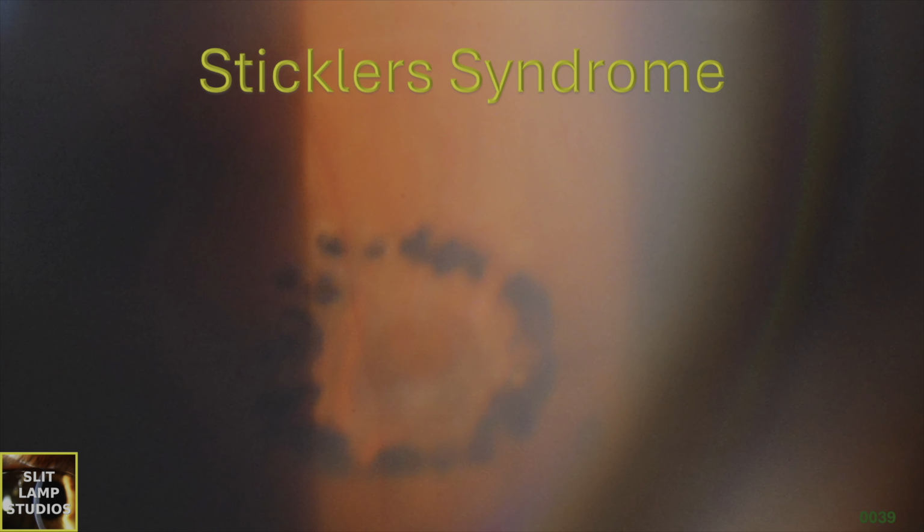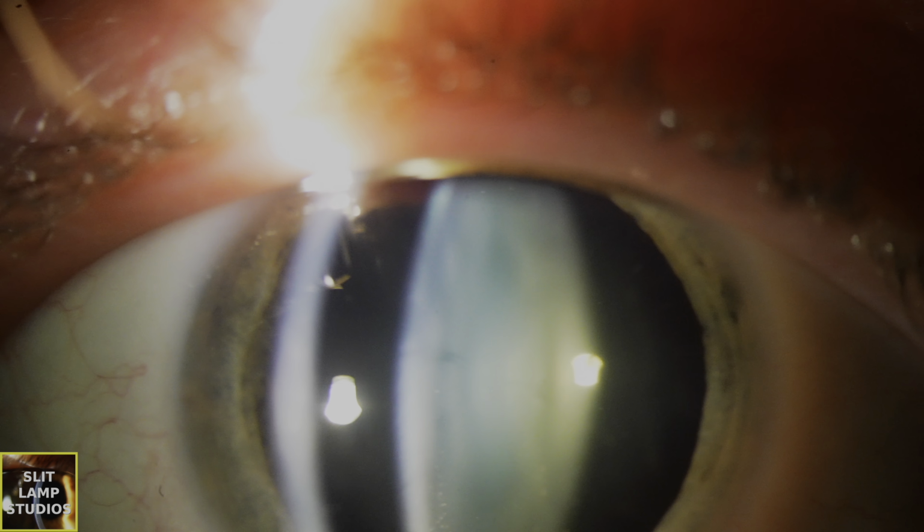Stickler's syndrome. In this video, we're going to be sharing the case of a young patient with this diagnosis. Now, let's first of all examine the eye which is phakic. And the thing that I want you to look at the most is the vitreous. Now, how would you describe that vitreous?